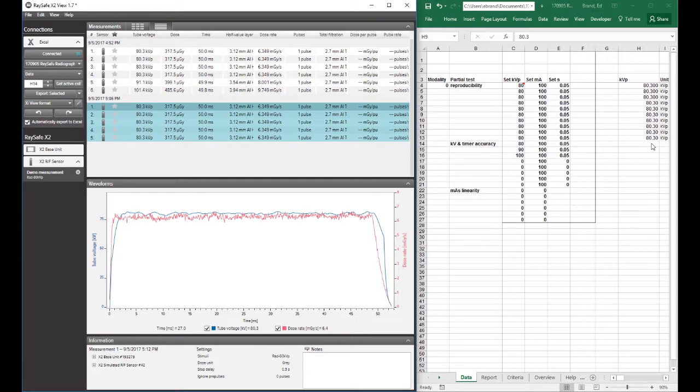So now I'm done with my reproducibility test. Of course what you'd do is you'd make one exposure after another. It was really a reproducibility test. But I just wanted to show you also how to import from the base unit.